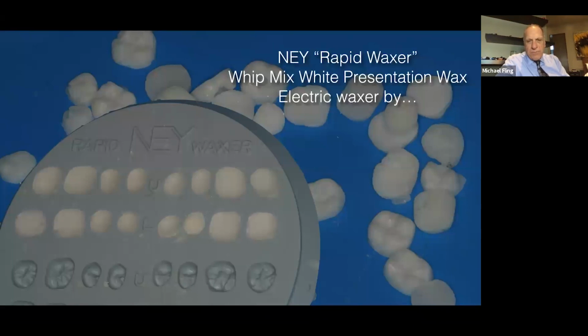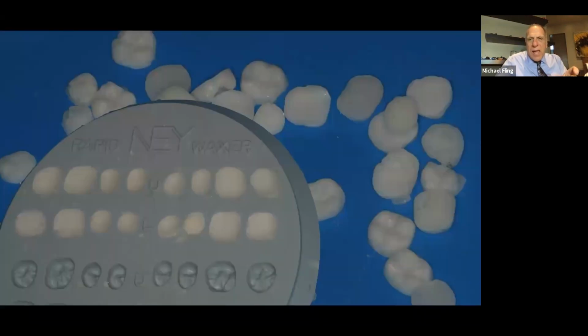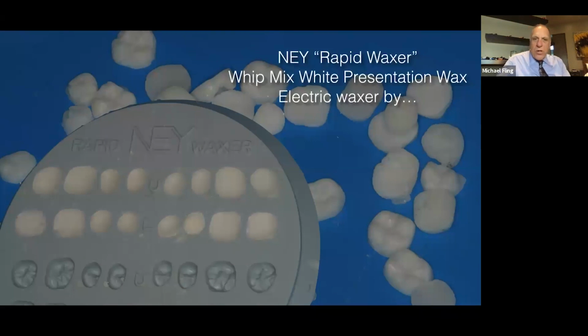Here's what you do. That waxer that I showed you earlier, that Whip Mix waxer, you turn that bad boy up to the highest temperature it will go. And there's a particular type of wax that I wax with. It's called white presentation wax. You get the white presentation wax both in stick form, and you can get it in a little tub where you can dip into it to carry it over for your waxing.